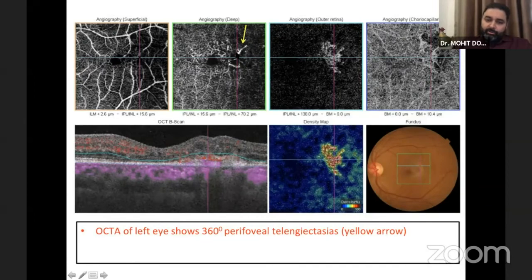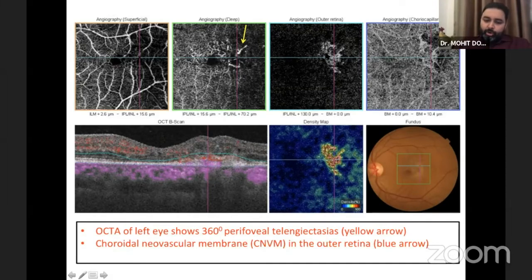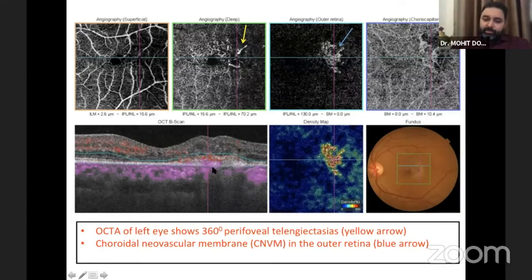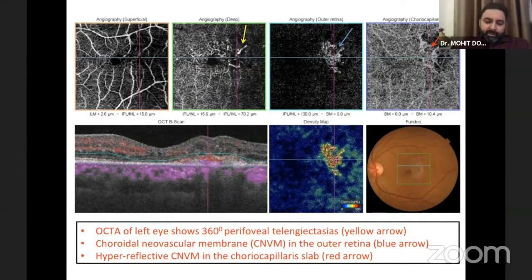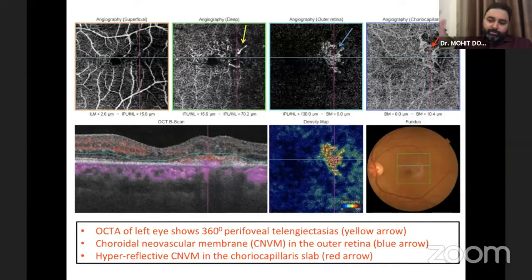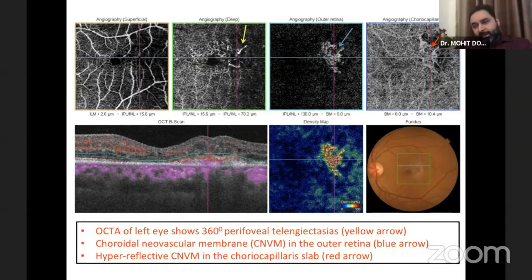The yellow arrow shows something similar to the right eye except it's not confined to the temporal area — it's more generalized, extending superiorly and nasally. Looking at the outer retinal and choriocapillaris layers deeper down, as seen on the OCT, there's hyper-reflectivity in the outer retina, and an imprint of that in the choriocapillaris layer, indicating abnormal blood vessels.